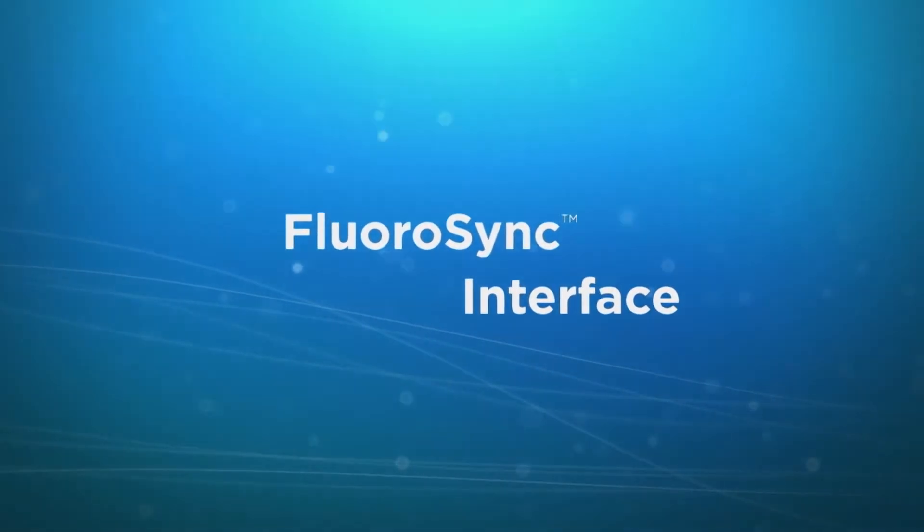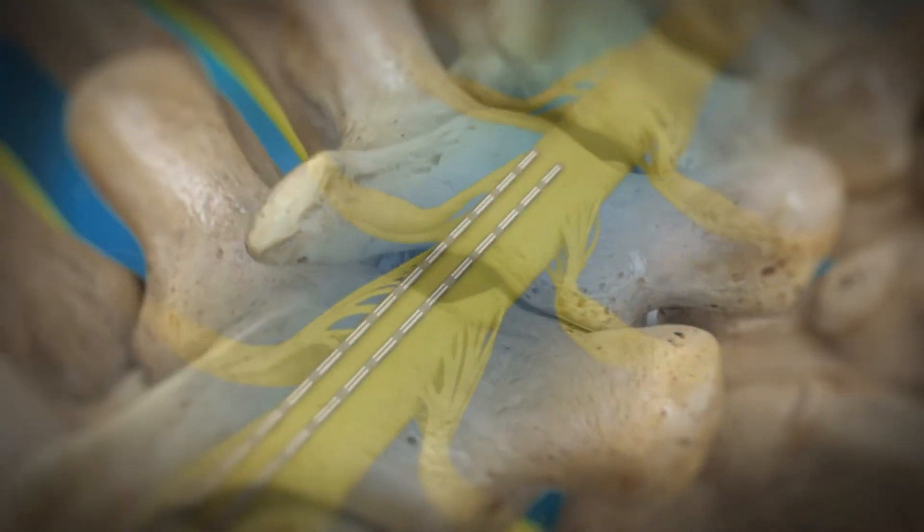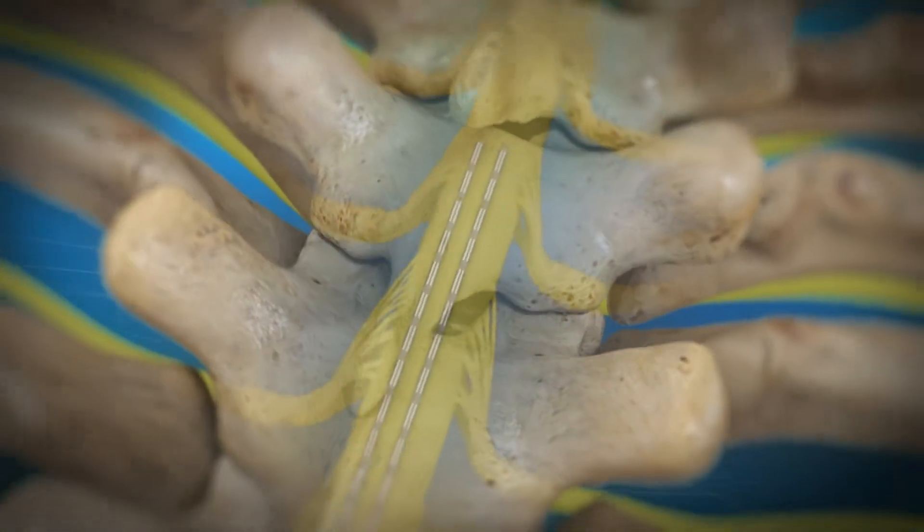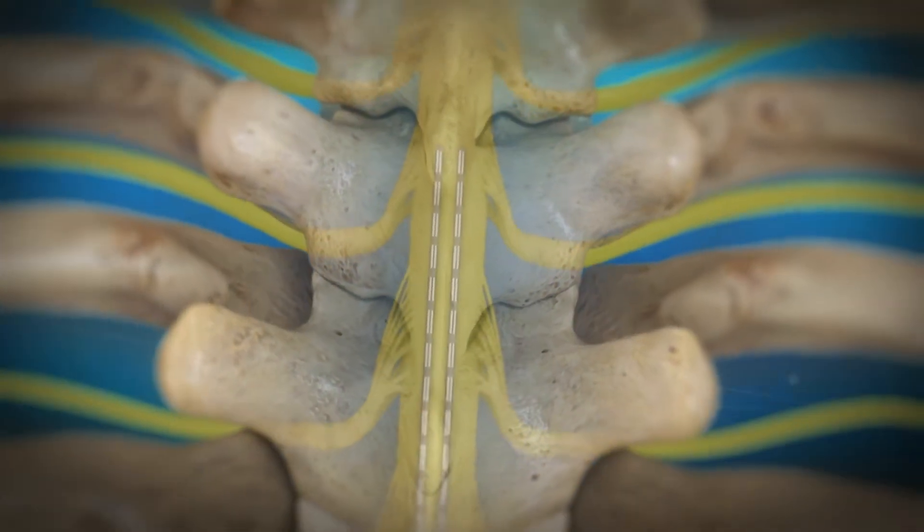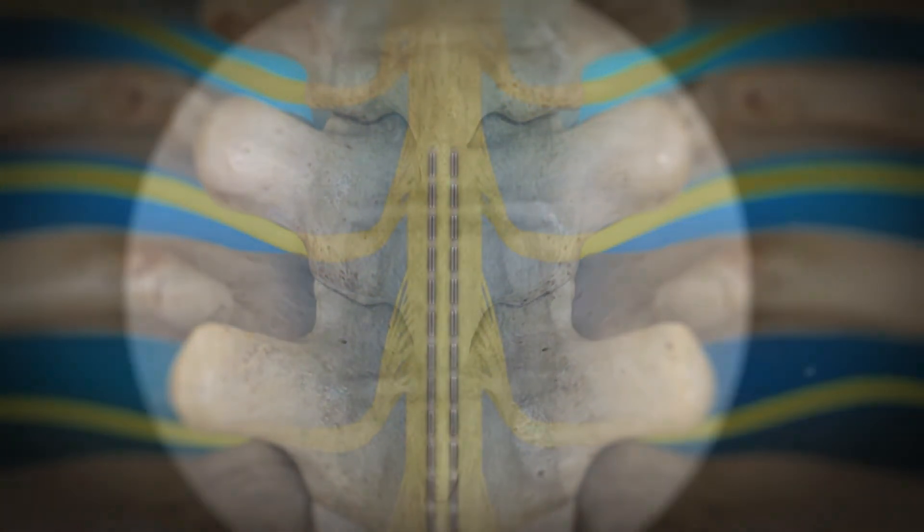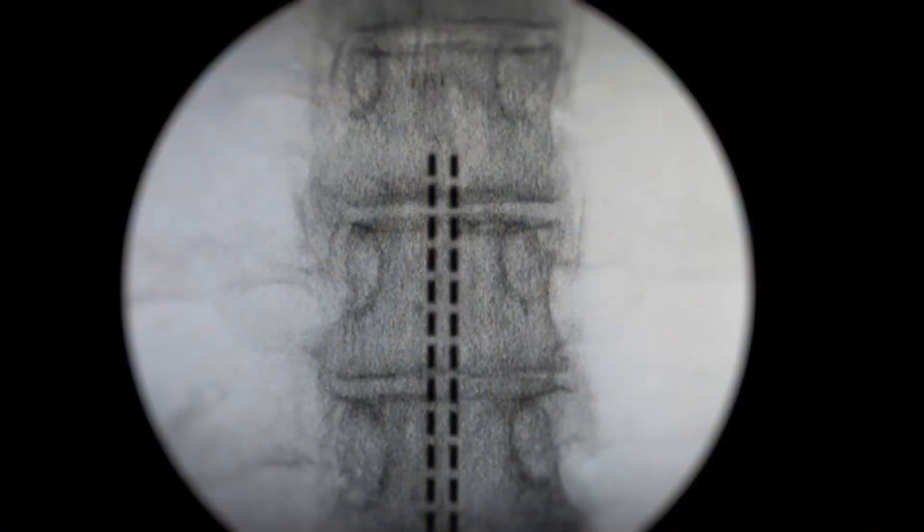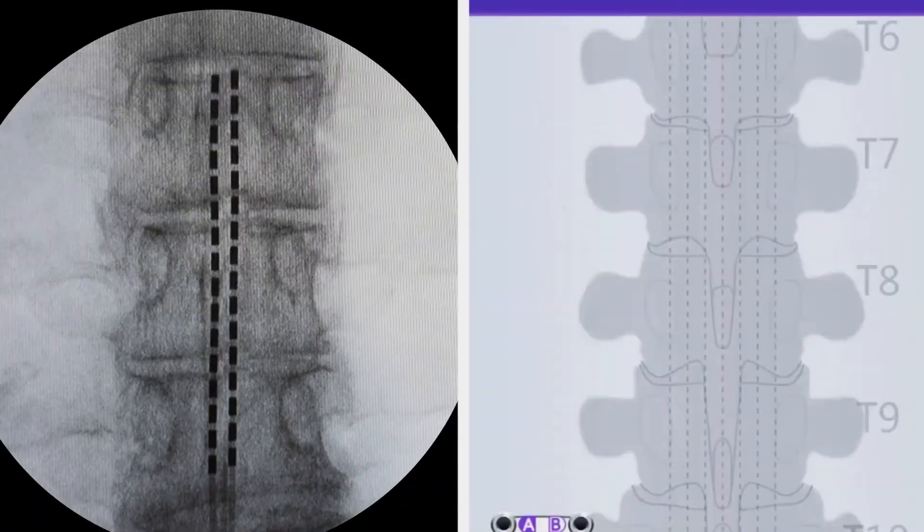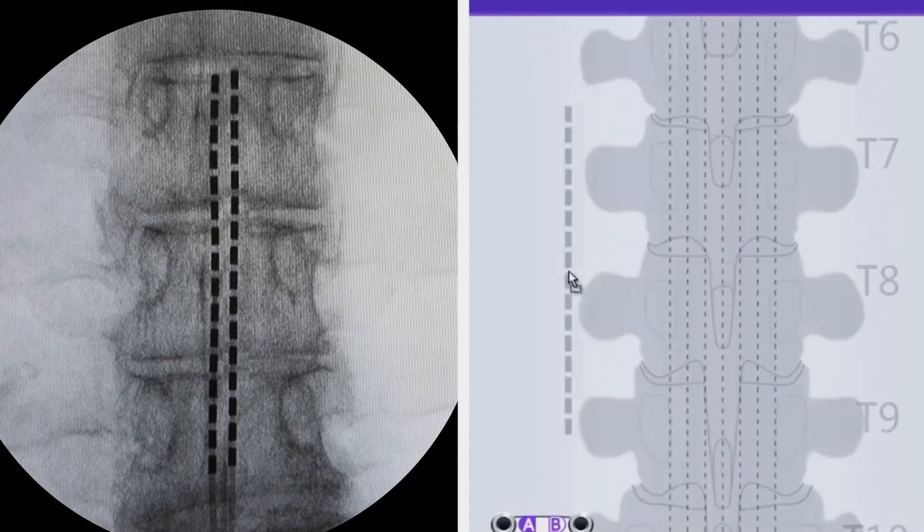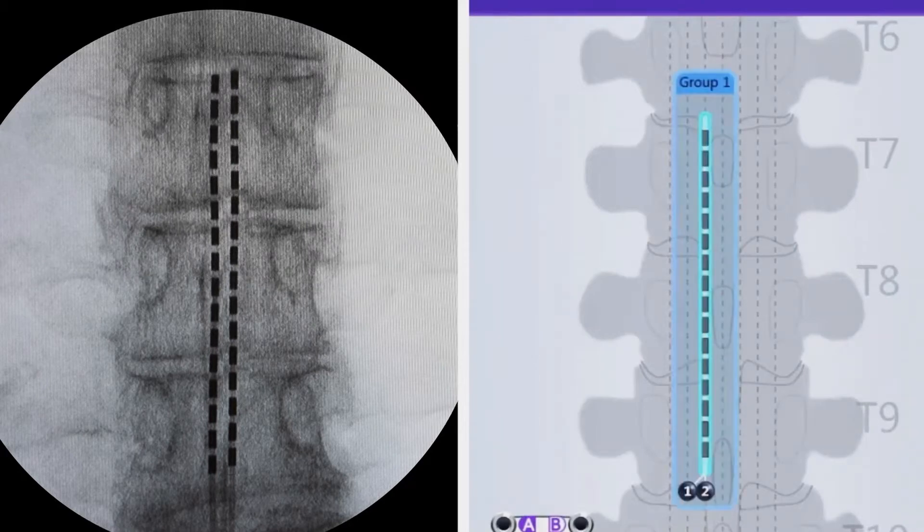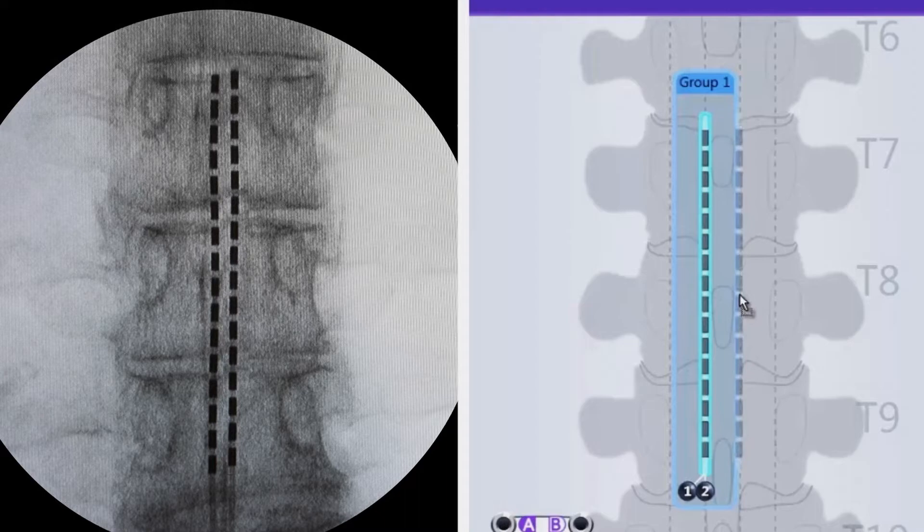Simple and intuitive, the FluoroSync interface allows you to mirror the fluoro in the programming software. Simply select the leads and drag and drop to the appropriate vertebral level and lead position so you can more precisely target the pain.